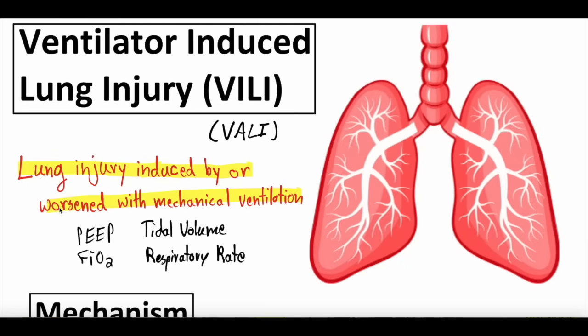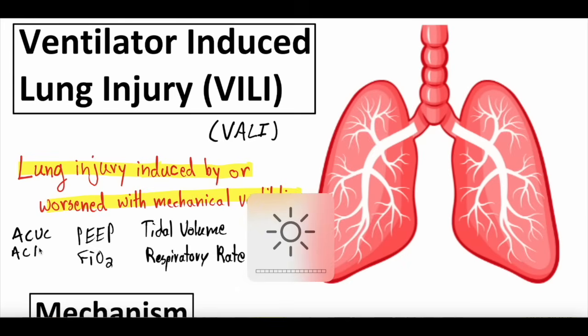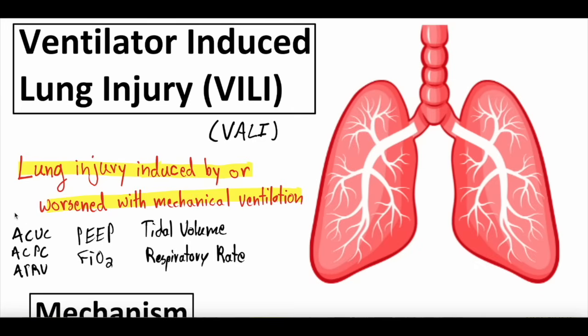There's even different mechanical ventilation settings, right? There's AC/VC, which is assist control. There is AC/PC. Apologies, our computer keeps going dark here. Or pressure control. There's even weird stuff like APRV, SIMV, lots and lots of different settings. So mechanical ventilators are quite complex. And as such, they're not perfect for the lungs. They're needed at times, but they're not perfect for the lungs.